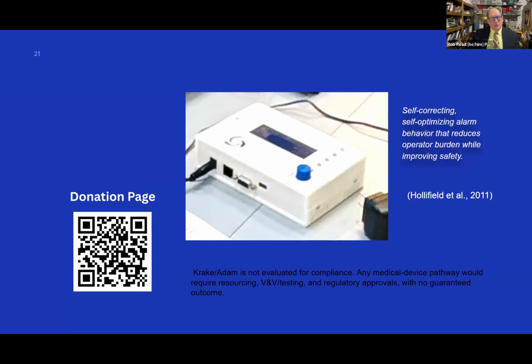The ADaM software is only just beginning. Cyturon has done some really interesting work, which is in our GitHub repo, including some simulations. But I'm confident that the combination of Alarm Dialog Management with an open source reprogrammable annunciator like the Krake will eventually be very valuable to a lot of open source teams or firms that are trying to save money by offloading some of the alarm design onto an open source system.